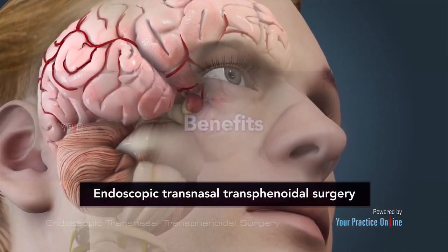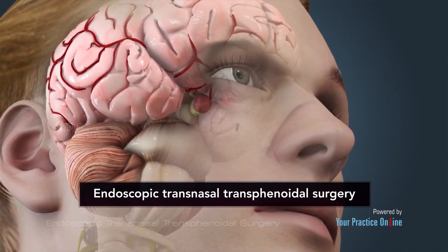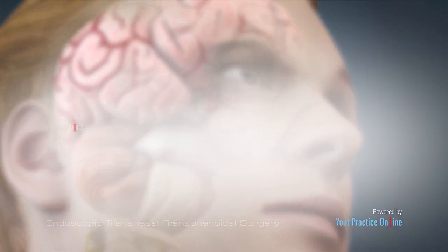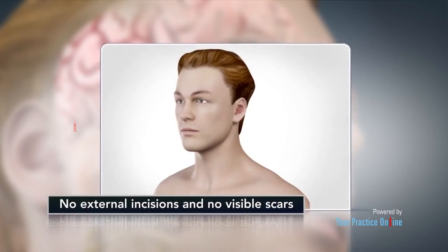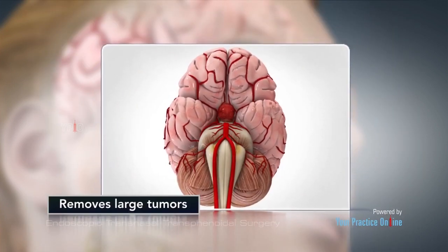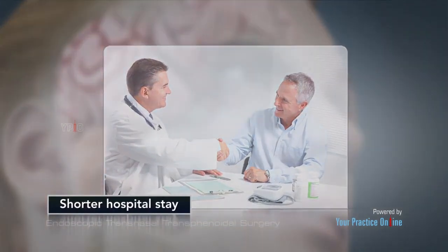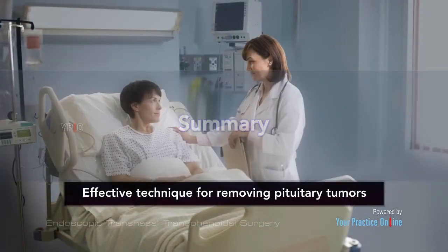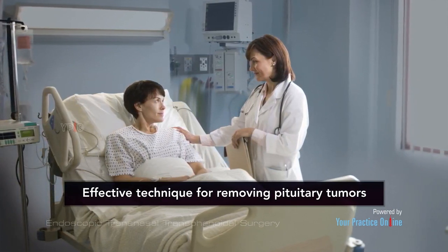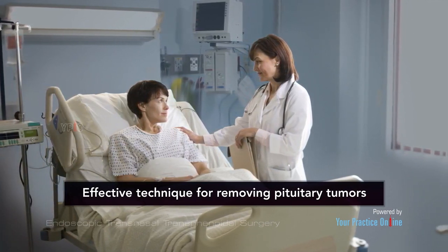Benefits. The resection of the pituitary adenoma through endoscopic transnasal transsphenoidal surgery has several benefits over open surgery, which include no external incisions and no visible scars, minimal loss of blood, removes large tumors, faster healing and recovery time, shorter hospital stay. Endoscopic transnasal transsphenoidal surgery is an effective technique for removing pituitary tumors. It is a safe, minimally invasive procedure which confers numerous benefits.